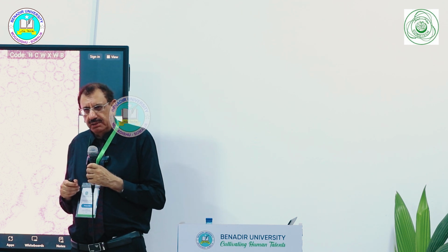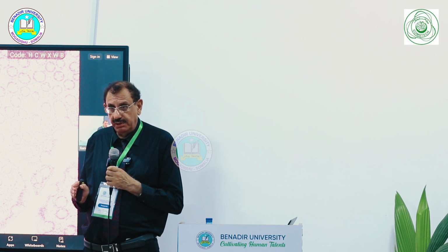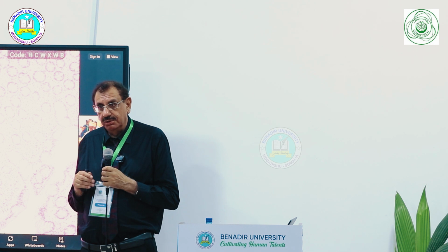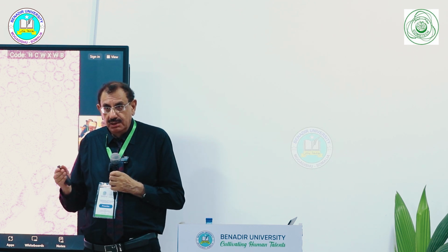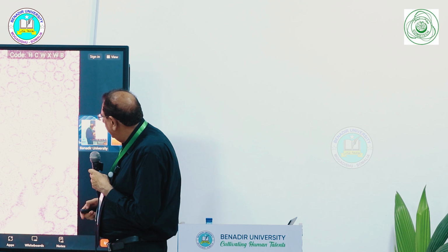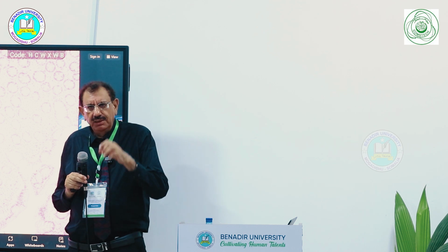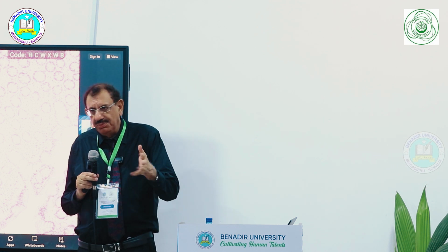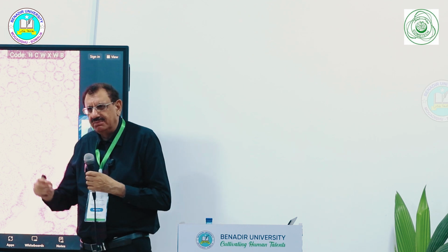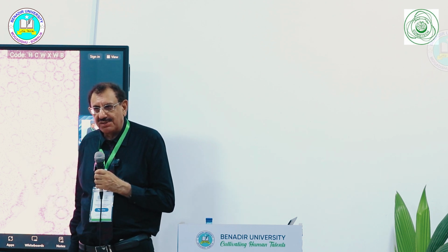malignancy in a stomach, if you are not careful, it's very easy to miss the diagnosis of signet ring carcinoma. And at the same time, if you are not careful, you may overdiagnose signet ring carcinoma. Many cells, sometimes even histiocytes, may look like signet ring, right? Most of the mistakes you make are when you are too busy or you rush things. I'm sure on low power, somebody will say it looks normal, no significant histologic abnormality is seen, or maybe at the most mild chronic non-specific gastritis.